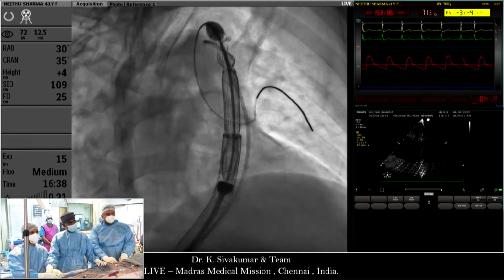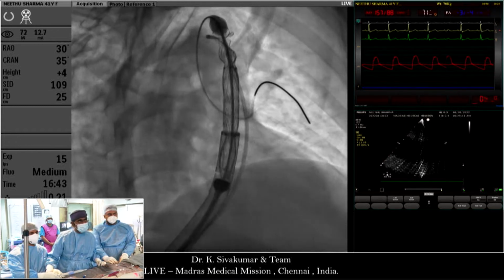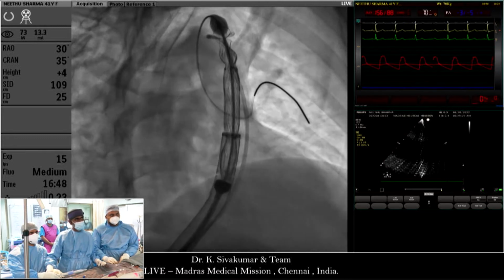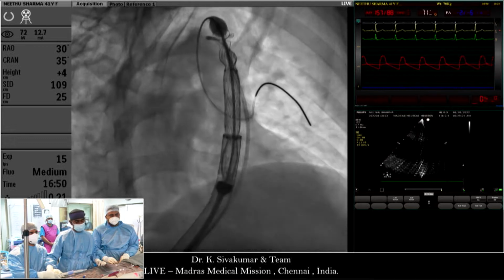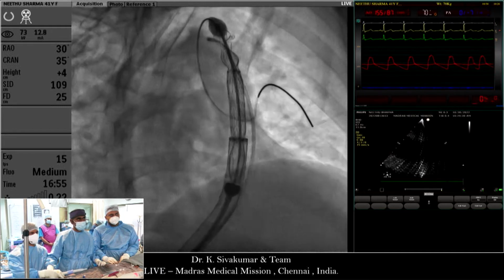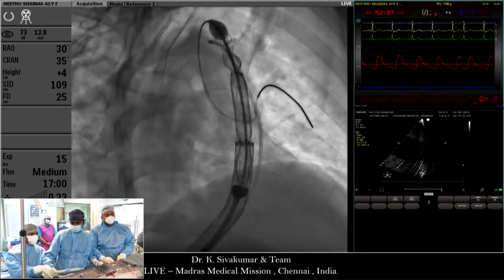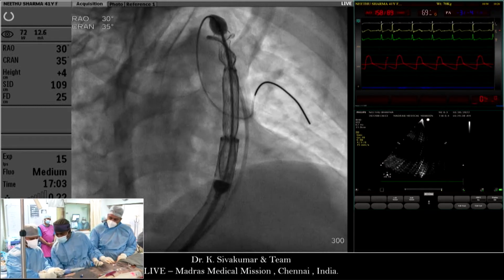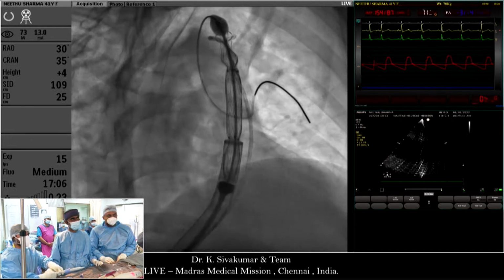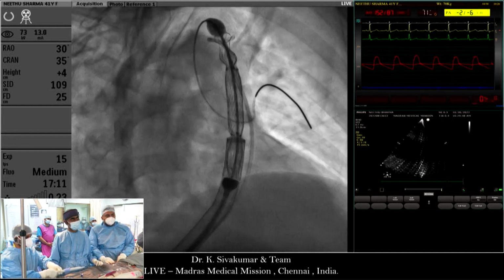Varakan, I saw you never use a long sheath inside the pulmonary artery before advancing the valve. With the measures before pushing the long sheath, how big a valve did you use? Did you change your idea before and after? Well, I have very limited experience, to be honest. But I will mainly rely on the balloon interrogation rather than this sensitivity from the sheath. But this is a good point, Jin, that you made.